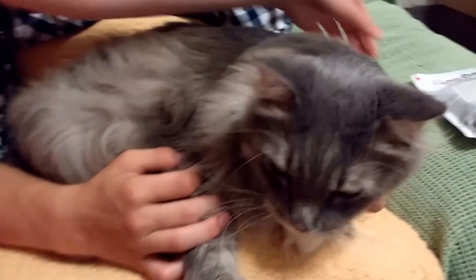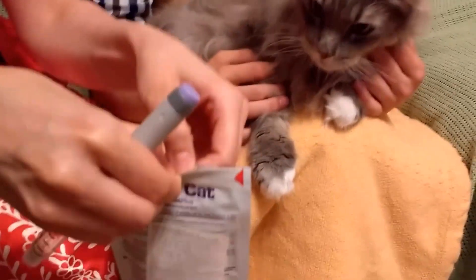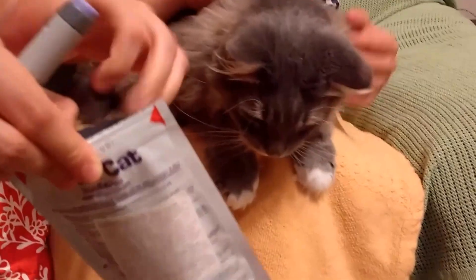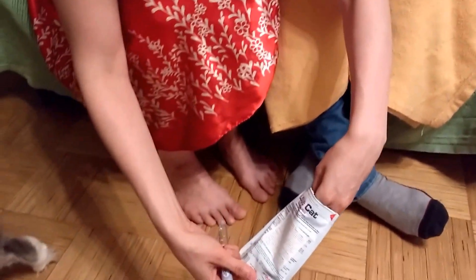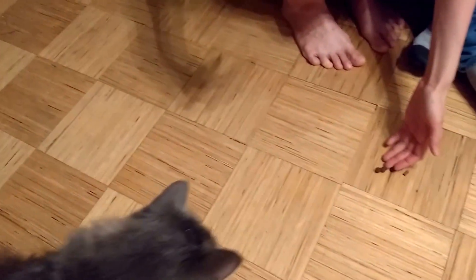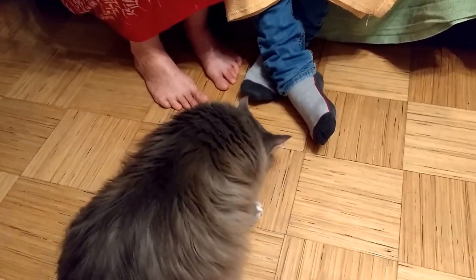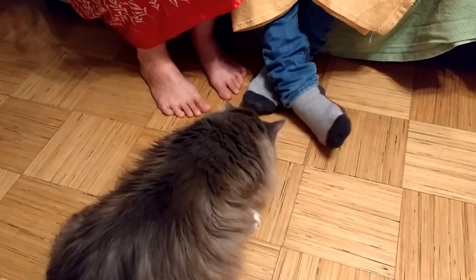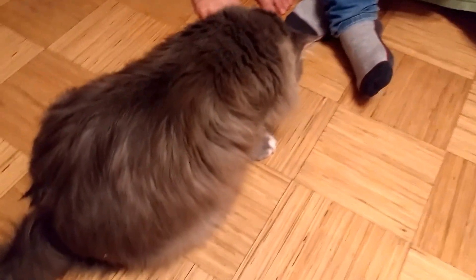Then you can stroke the cat. It's always good to give your cat a treat — as you can see, the cat likes the treat. Come on Sonsu, have a treat. Later, when your cat is used to having injections, you don't need to give anything.